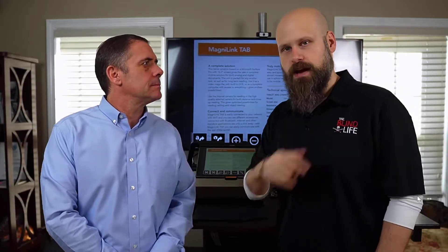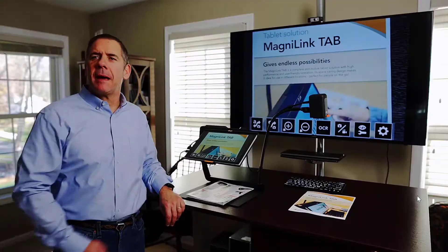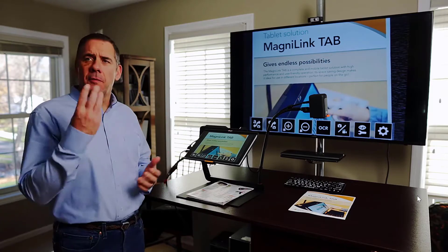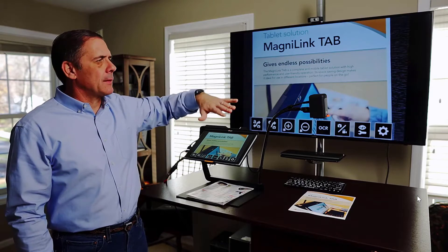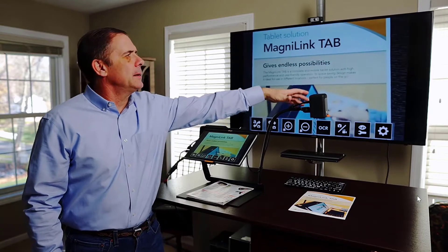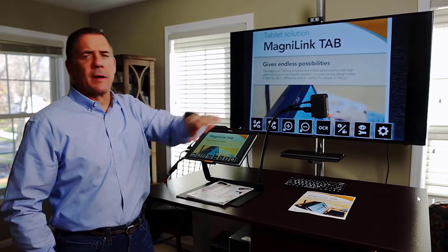So here is the MagnaLink Tab — the device that folds up, battery operated, transportable, has a three-camera system in it. As you can see, I have a camera on an arm that completely rotates and moves all around the device, allowing you to do distance viewing by rotating, or look down at your paper — great for in the classroom.